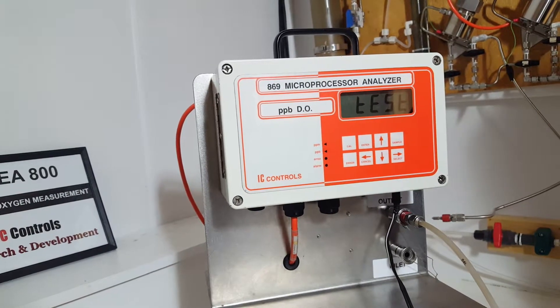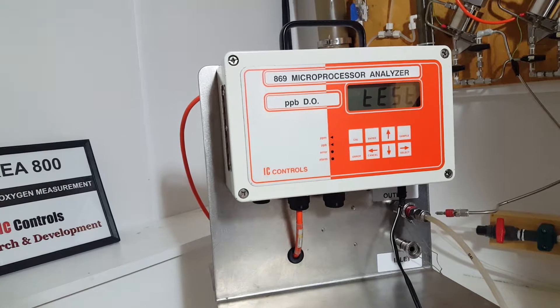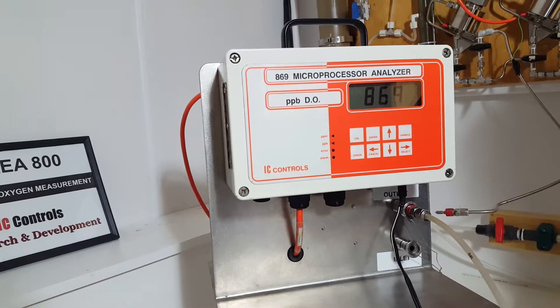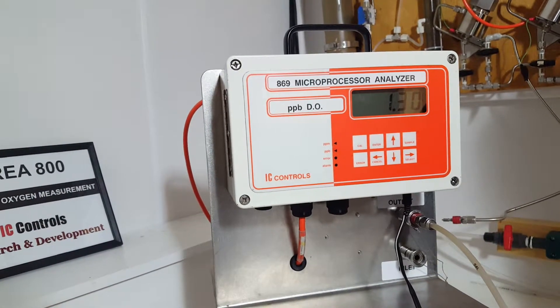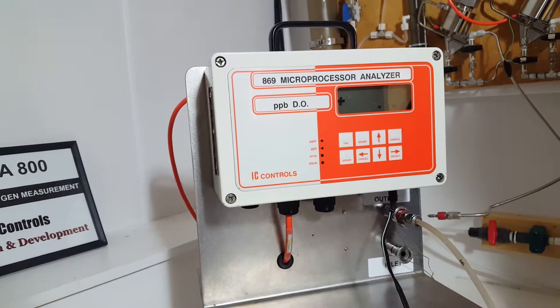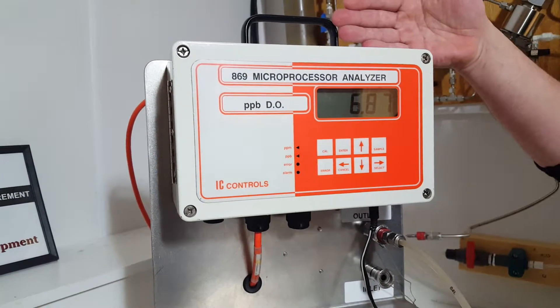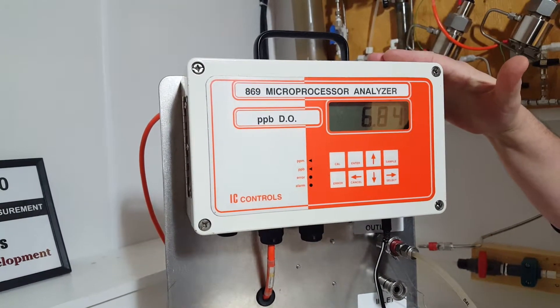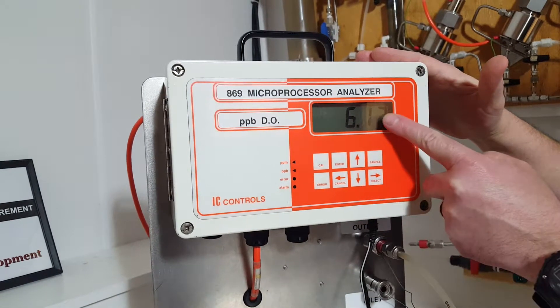Once it's done running through its boot up sequence, the first measurement you'll see will be your DO reading. It's just a programmed version — that 1.3 is your programmed version. There's your dissolved oxygen reading. Your display can show three parameters, and by using these arrow buttons you can switch through them. This is your DO reading.